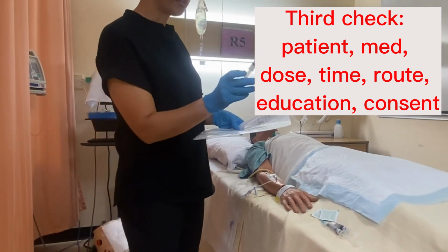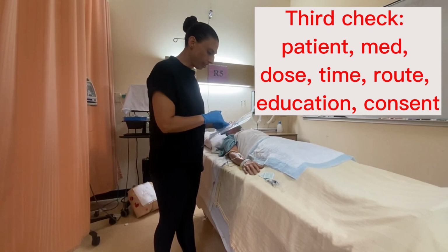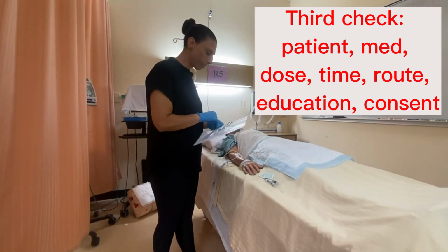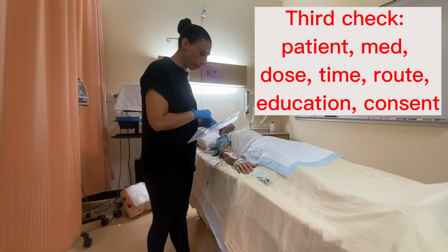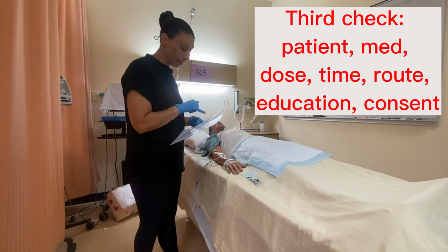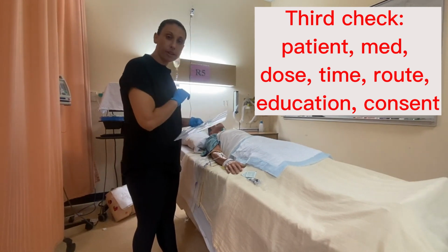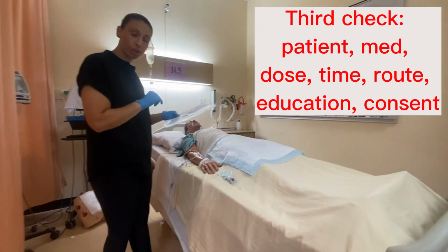So now I'm going to have my syringe in hand, and I'm going to make sure that this is the correct syringe, that I haven't mixed it up with somebody else's syringe. Morphine, perfect, 5 milligrams, 5 milligrams. This medication has not been given yet, and it is due right now, and it is IV, so that is correct, and I've identified the patient correctly. So I have done my checks.